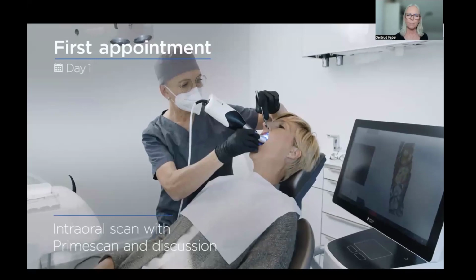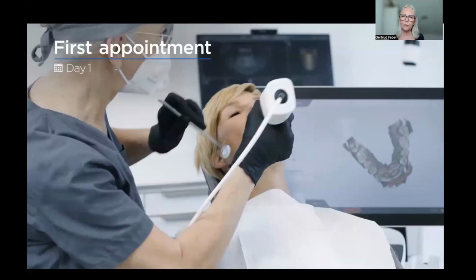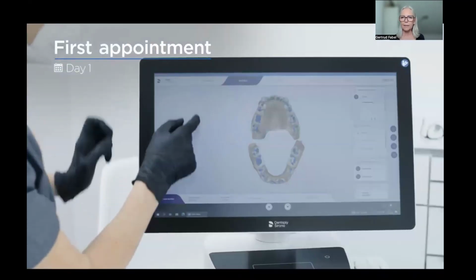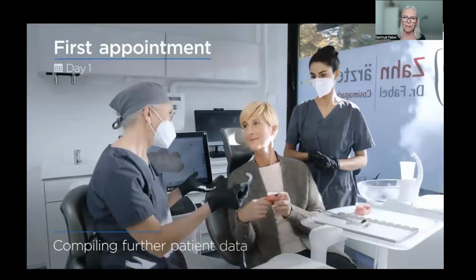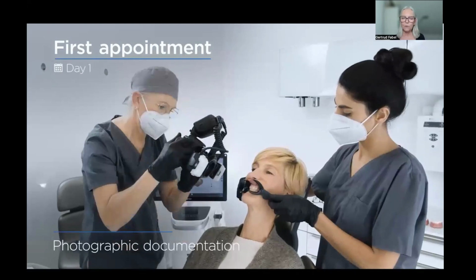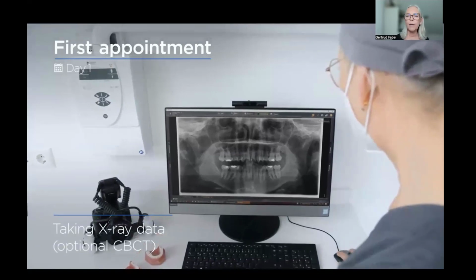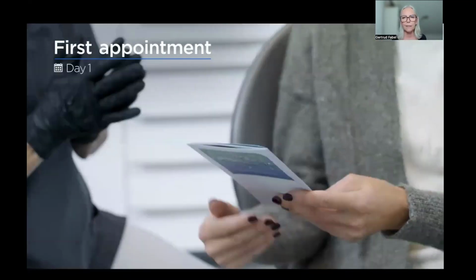So the patient comes and we make a scan, be it myself or one of my assistants. We explain everything, I mean, the contacts. We show the quality of the aligners. And in the end, we take some photos, intraoral and extraoral, and then a panoramic view or a CBCT, whatever is necessary.